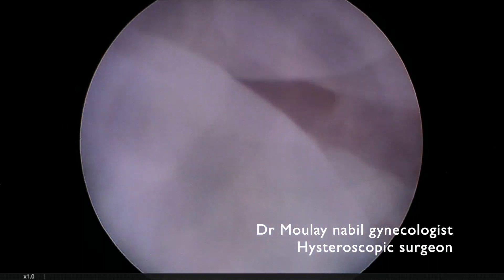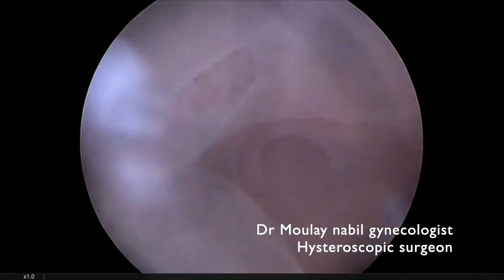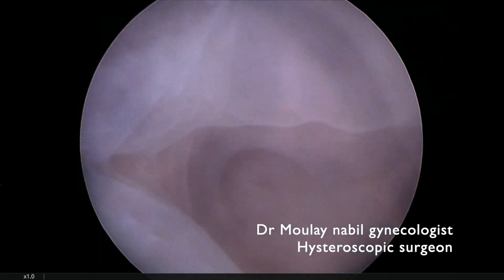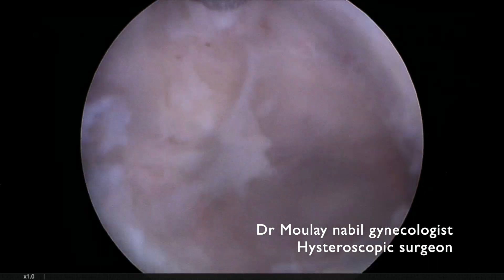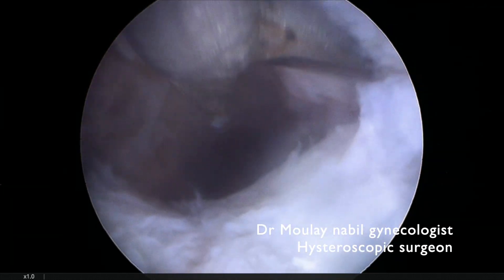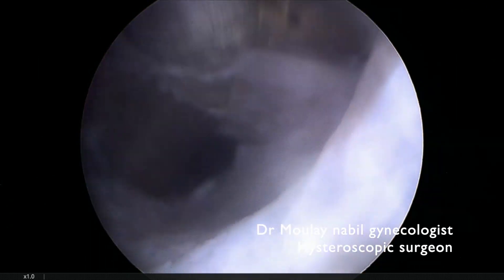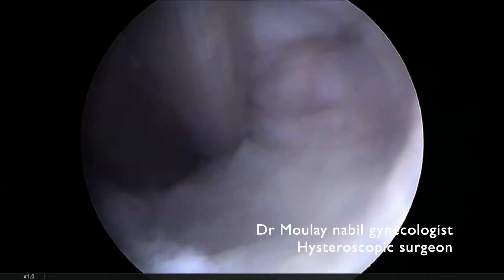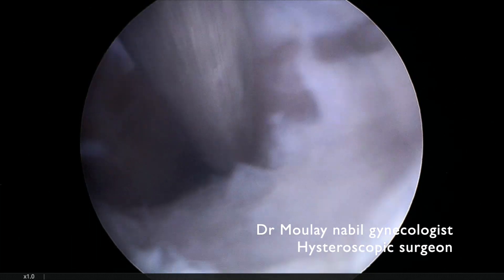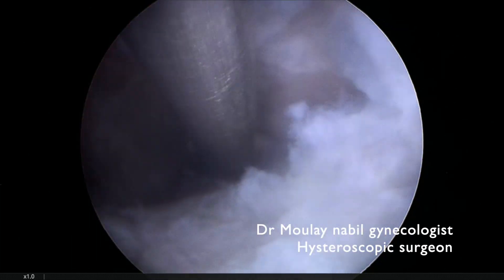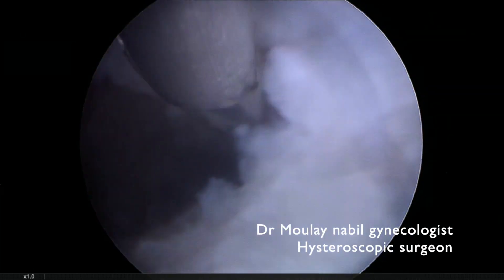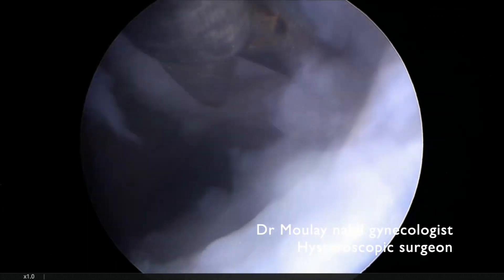But the right part of the uterine cavity is completely plastered, and our goal is to try to increase the uterine cavity volume as much as possible. So we begin the section by the lateral aspect of the uterine cavity.